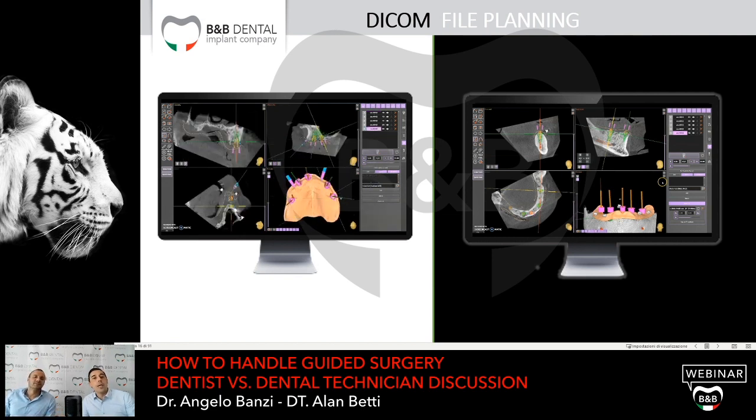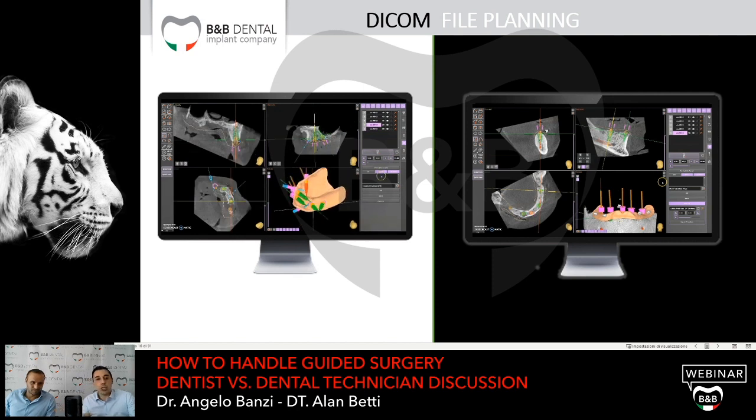So in this case, we have to find the solution, and we can move up the sleeve in position +2, so we can move up the sleeve for 2 millimeters or 4 millimeters. This is in the virtual world, just in the virtual world, during this planning process. The technician or I can do it by myself. It's not a problem to move the sleeves 2 or 4 millimeters above the standard position.